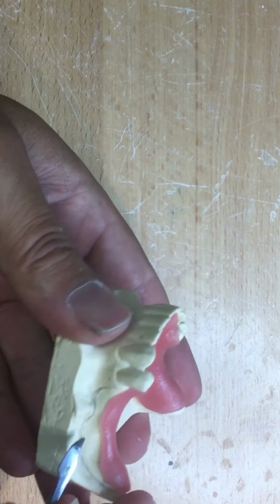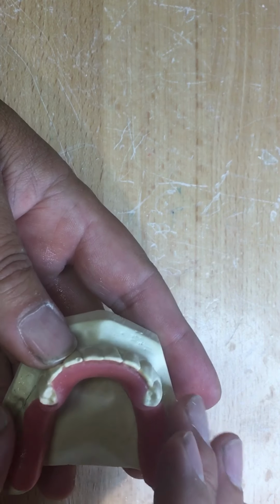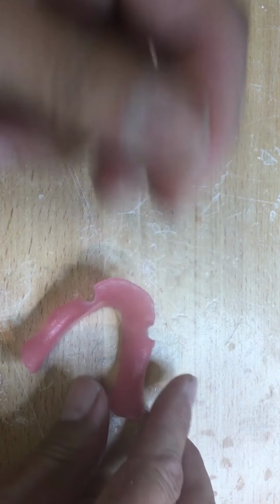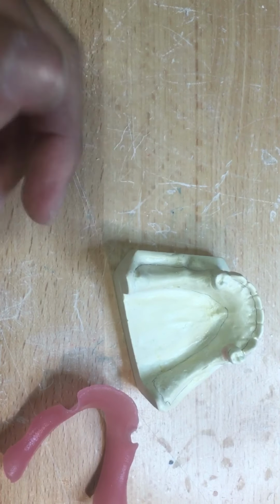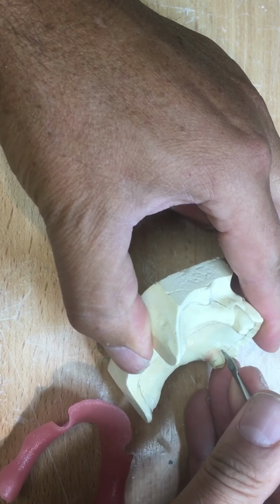So you need to commit those to memory for the week 2 quiz on the purpose of the partial edentulous occlusion rim, which is really similar to the occlusion rim of the full denture, except that it's only half of the reasons, depending on how many of the teeth are missing. In this situation, we're missing 5, 6, 7.